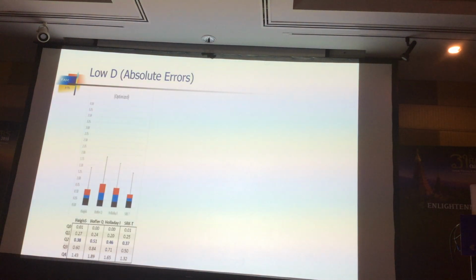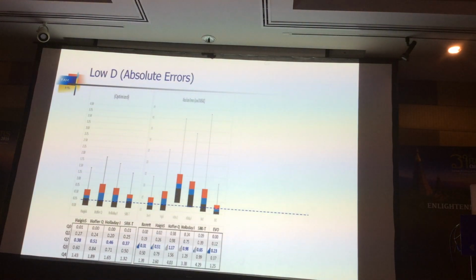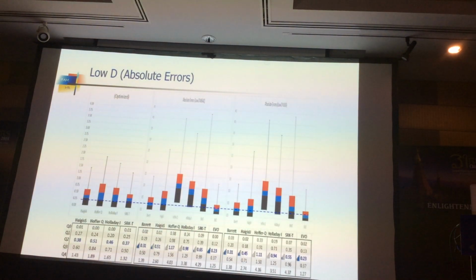All right, look at absolute error. Of course, you can optimize it. You're going to skip that because that is not easily available. If you use what's on the box, it's quite obvious. There are two shorty there. Shorty is good here, Evo and Barrett. And then what is on ULIB, Evo and Barrett. So for this very long eye, ULIB may not have the constant.